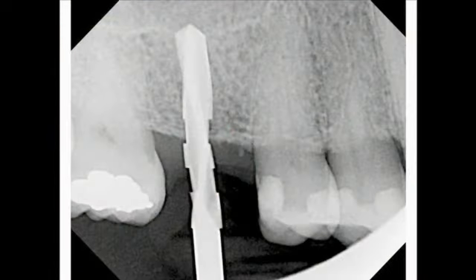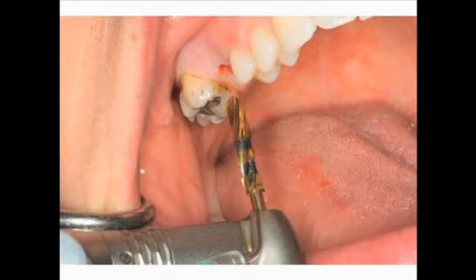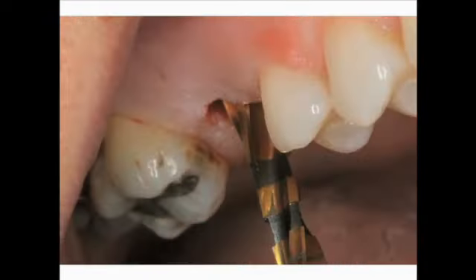Here again, we're looking at the radiograph of the 3.3 millimeter twist drill in the site. Note the notches of the drill itself. The first break is at 7 millimeters. The second indentation is 9 millimeters, and this was intended to be our final depth, just at the floor of the sinus. So we're in a really nice position here. We then go to a 4.1 millimeter twist drill with an actual diameter of about 3.5 millimeters.